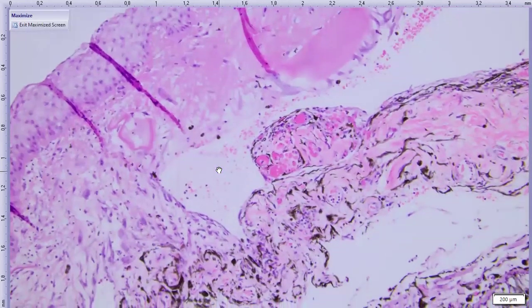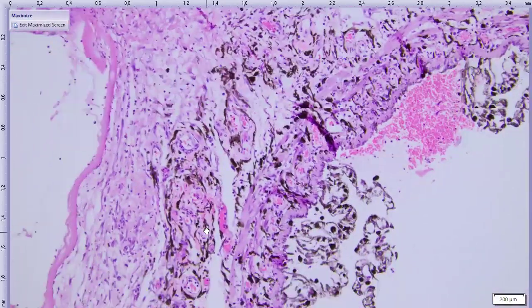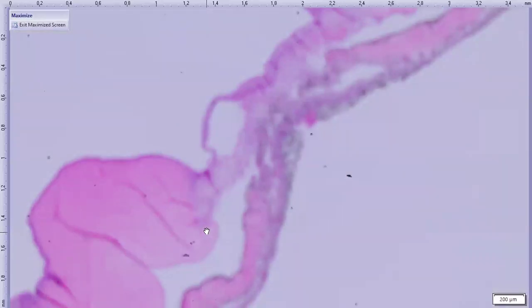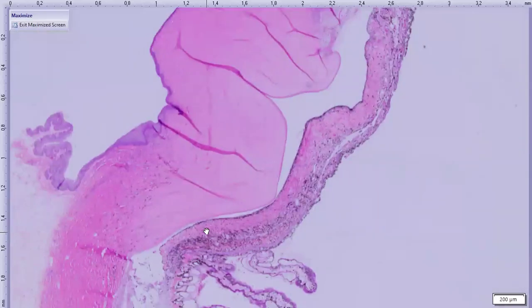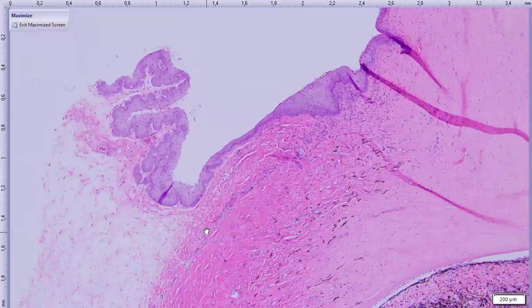Again, with our iris stroma coming in and attaching to this material in the perf, trying to plug it up and keep it intact. There's just a little bit of neutrophilic inflammation in the rest of the cornea, kind of leading up to that perforation.